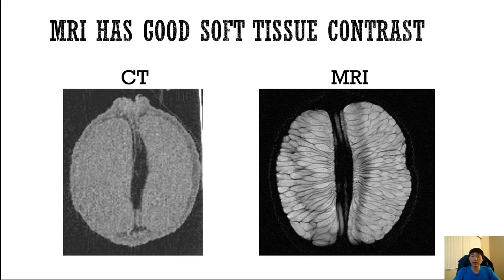Or even if the implants are not magnetic, so for example, titanium implants are not ferromagnetic in the sense of having a strong attraction to the magnetic field, these metal implants can heat up with the oscillating gradient and also with the radio frequency excitation. You can heat up these metal pieces in the body, even though they're not attracted to the magnetic field, and this can cause quite a lot of damage. So every patient that comes in has to be screened in order to assure that it's safe for the patient to undergo MRI.